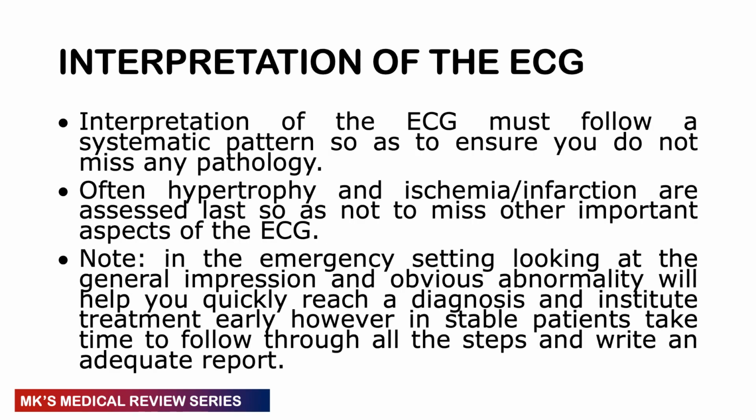Remember that interpretation of your ECG should follow a systematic pattern so that you can ensure that you don't miss out on any pathology. In how I arranged the schematic and how we are going to be interpreting the ECG, I made sure that I put assessment of hypertrophy, ischemia and infarction as the last things that you do, because sometimes you're going to be blinded just by looking at ST segment elevation and you may miss other important aspects on the ECG.